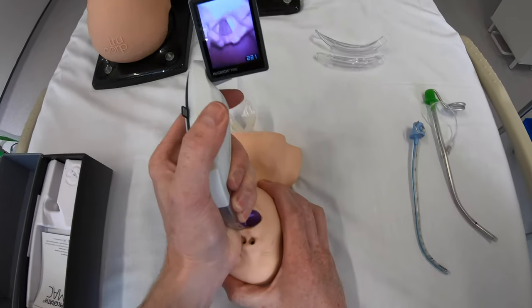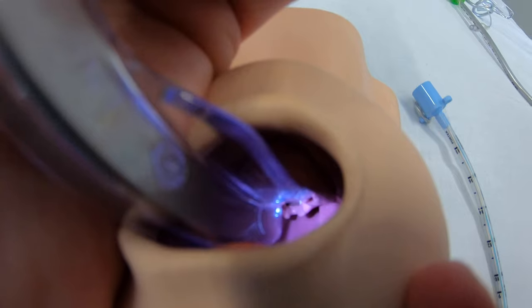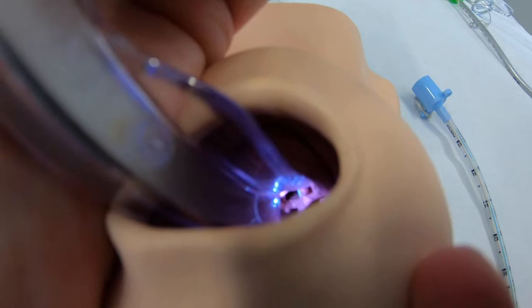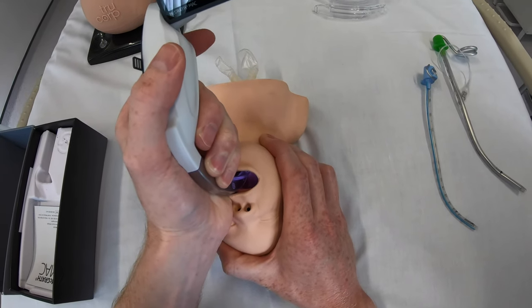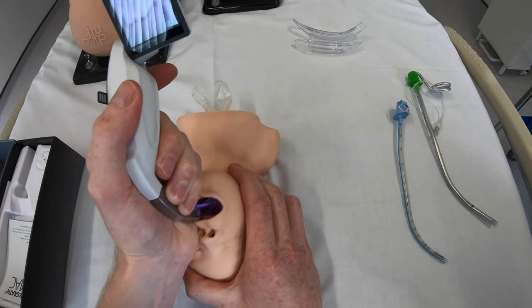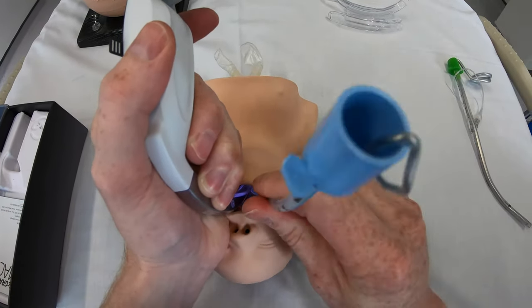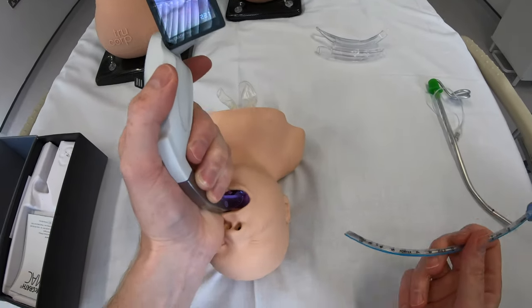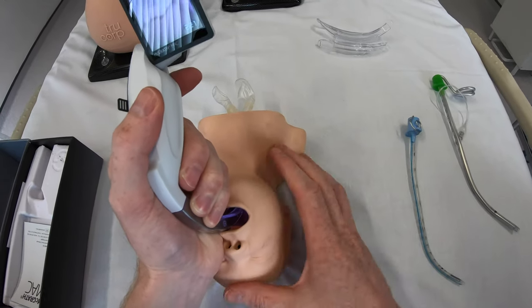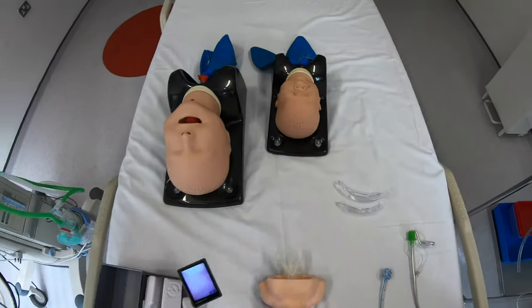Looking at direct laryngoscopy, the view is just as good as on the screen — having reviewed all major video laryngoscopes, that is an incredibly rare feature, and again it's the first thing that struck me when I looked at the blades: just how thin they were. So I've got a perfect direct view and can do the intubation with direct laryngoscopy. That's a great feature: should secretions block the video view, you can use direct intubation to secure the airway.